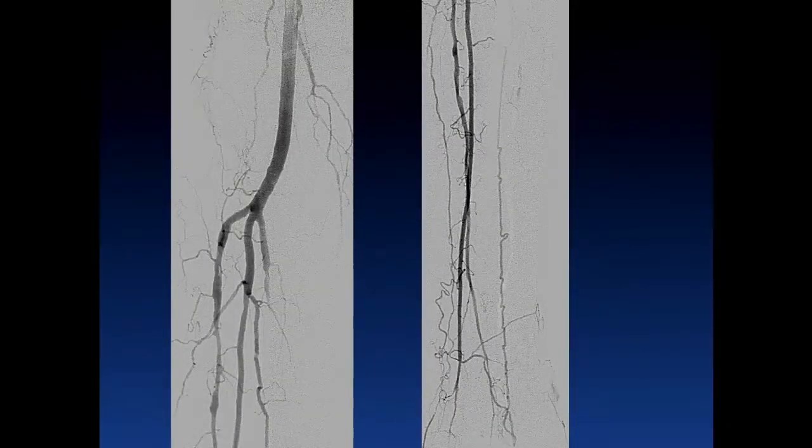So I went in and started with some initial balloon angioplasty. This didn't appear to be a particularly calcified lesion, although I think you can appreciate that there's some calcification up here in the mid-anterior tibial. I did long segment balloon angioplasty, as is my usual standard approach. This is a 2.5-2.0 by 220 Nanoballoon. So it's a tapered balloon, 2 millimeters distally, 2.5 proximally. I like these for below knee interventions because they can be very useful for long segment angioplasty. And this is a fairly conservative balloon angioplasty for the initial dilation.